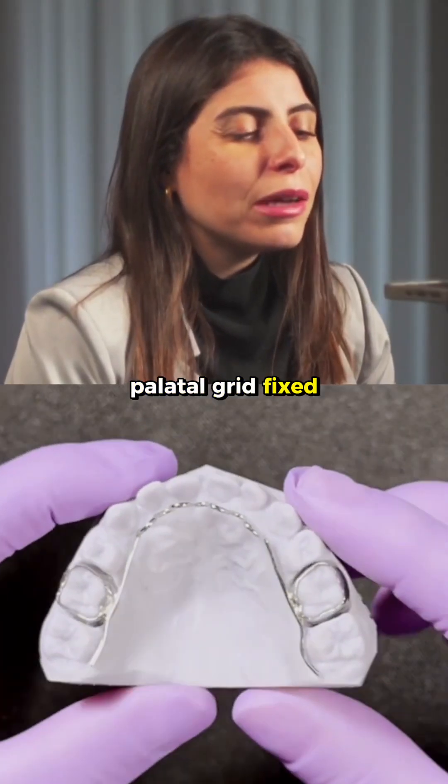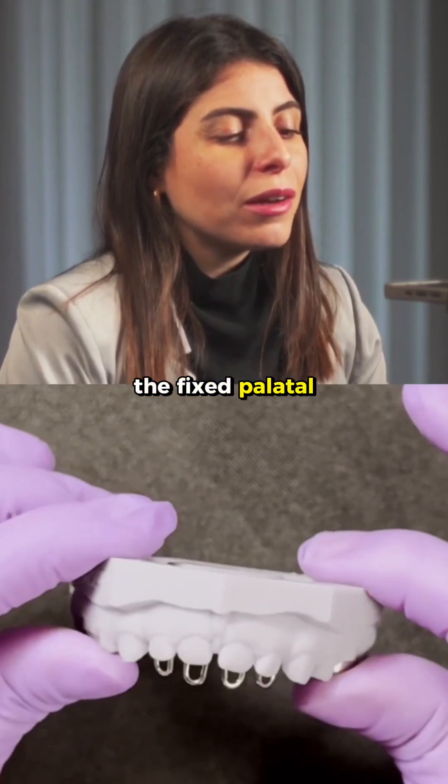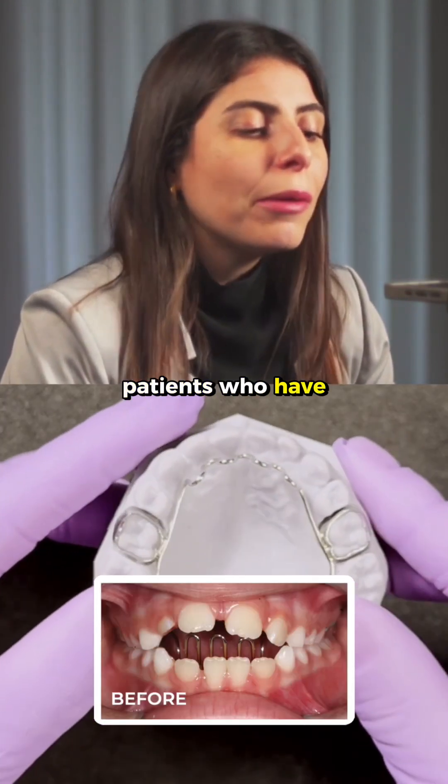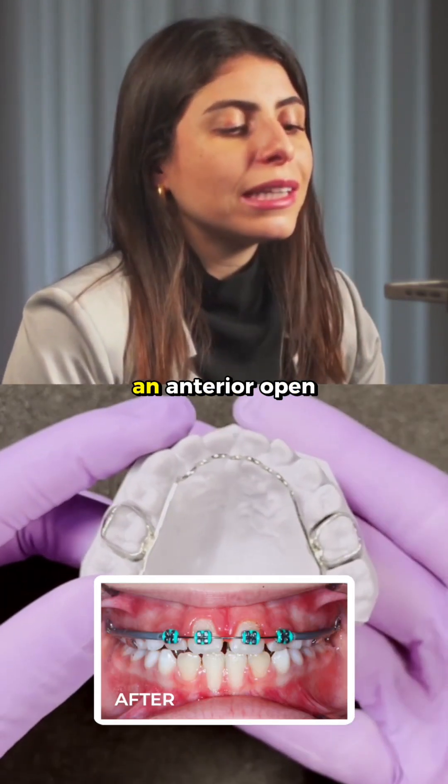Palatal Grid — fixed. What are the essential tips about this appliance? It's very important to note that the fixed palatal grid is an appliance used to treat anterior open bite in patients who have a sucking habit, or in patients who have already stopped the habit but still have an anterior open bite.